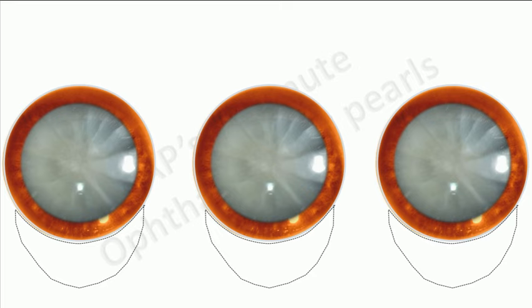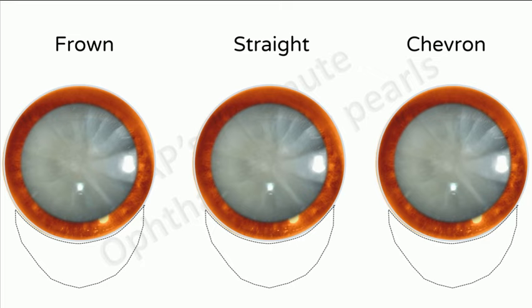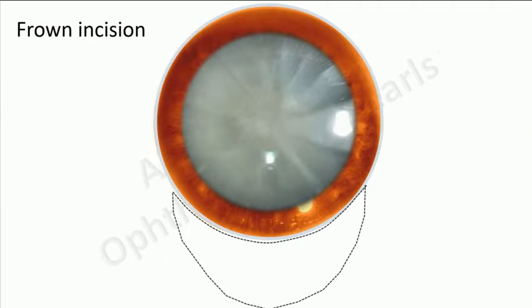For the first planar incision, three types of incisions can be made in SICS. They are the frown, straight and chevron. What do they look like? This is the frown, this is the straight and this is the chevron. The chevron produces the least amount of astigmatism but is technically difficult and hence not commonly performed.